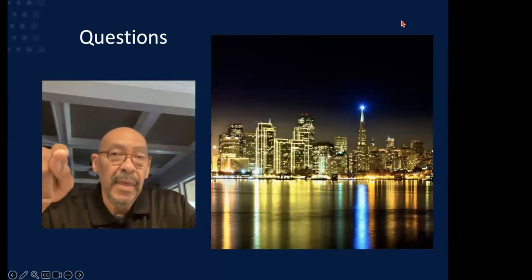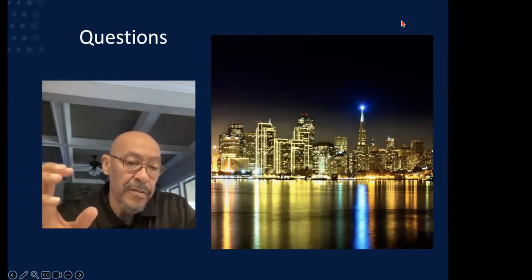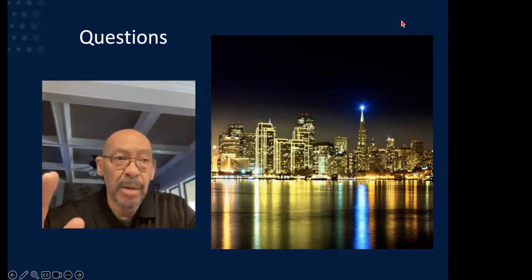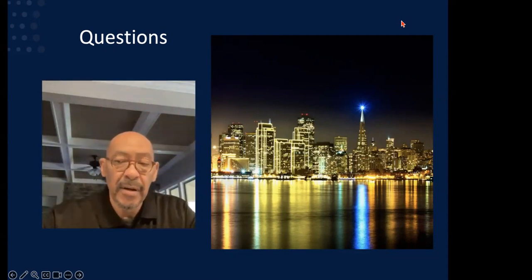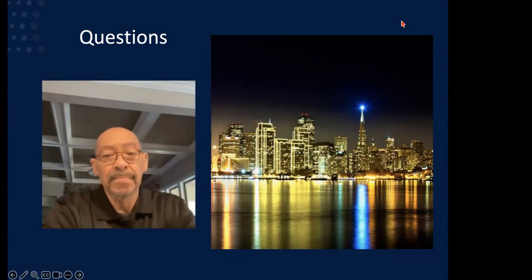And when your pupil comes down, the pupil and the iris is the color part of the eye. The pupil is the black hole in the center. Once all of that resolves and it comes down, you don't even see the optic in the eye unless you have a very discrete light shined in the eye that shows you the little optical shimmer that happens when you have these lenses in the eye. Other than that, you won't even notice the person that has it in their eye. So the annulus, that black area, holds that lens in place.